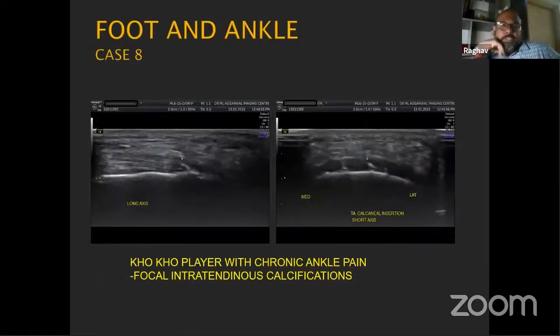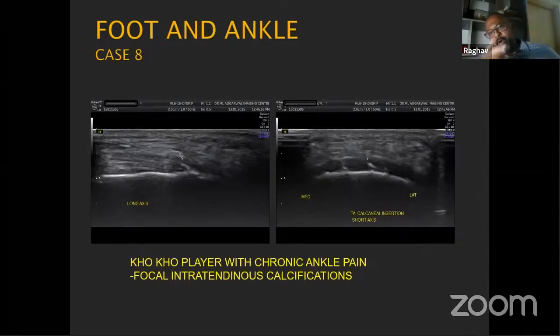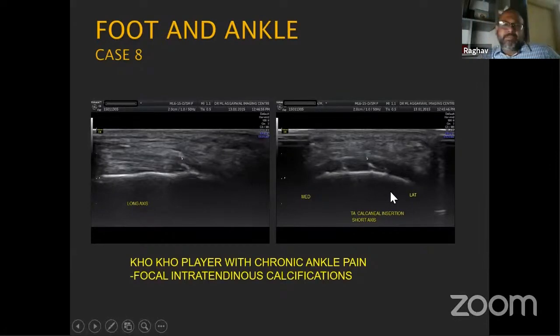A patient, this was a sportsperson showing a calcific tendinosis. So on the ultrasound, I could diagnose these tiny sub-millimeter calcifications. We could do a barbotage for them, maybe in the same sitting or in discussion with the orthopedic surgeon, or follow them up, because the MR might not be too useful in showing these tiny calcifications.